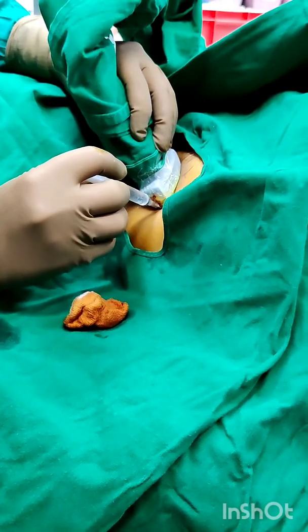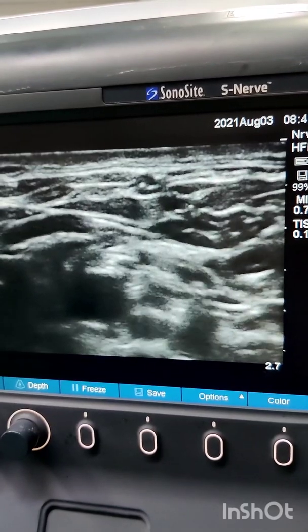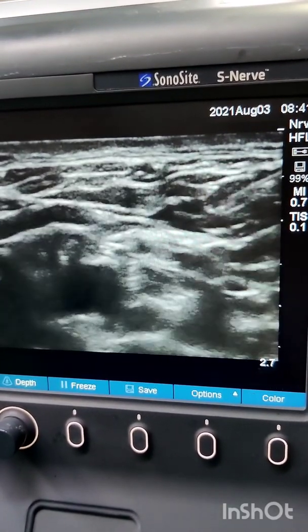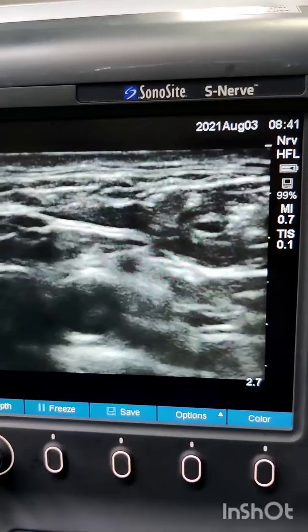Using a 26 gauge short length needle, about half ml of 2% lignocaine is given for local anesthesia. The needle can be seen in the subcutaneous tissue. Inject the local along the needle track and avoid deep injections. Avoid piercing the underlying fascia, especially if you are going to be using a peripheral nerve stimulator.